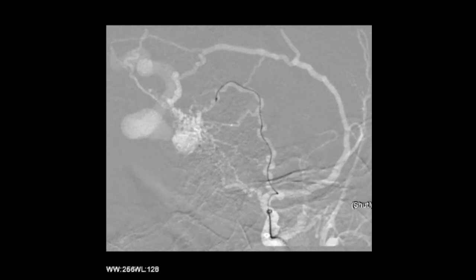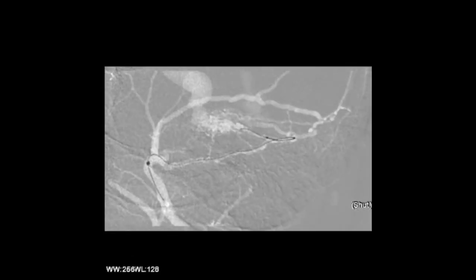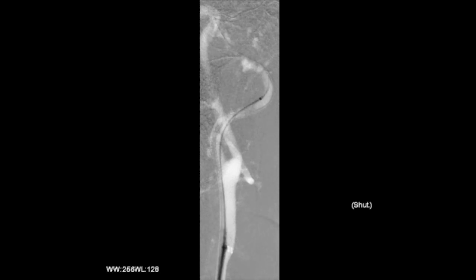Notice that the petrosal branch is quite tortuous, and in order to place the microcatheter distally, one has to take the intermediate catheter, here 044 DAC, as high as possible into the middle meningeal artery. Injection from the microcatheter shows a high flow fistula.